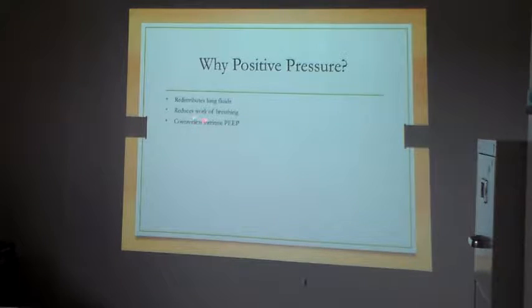It counteracts your body's intrinsic PEEP. So instead of your body trying to keep air in, it automatically keeps air in. It forces air down with every breath. You don't have to worry about that. So this is your blue bloater, your person that has pursed lips because they're trying to keep air in. You don't have to worry about that because it already does it. When they do that, it means that they're working very hard to breathe. Now you don't have to.